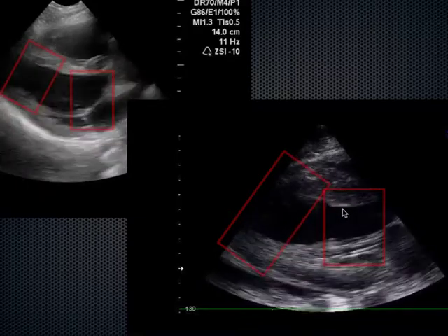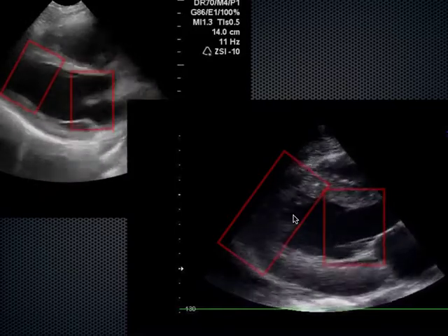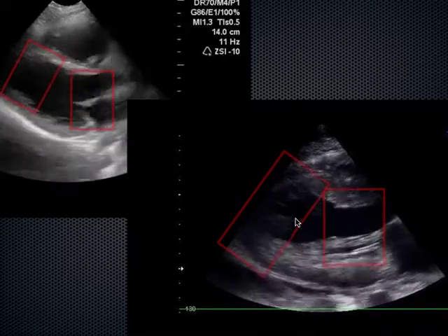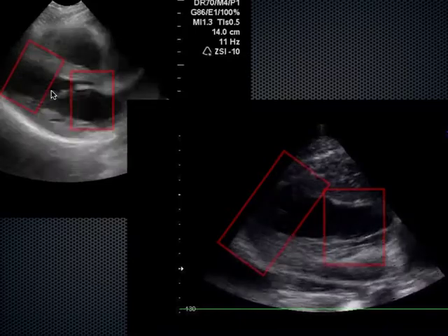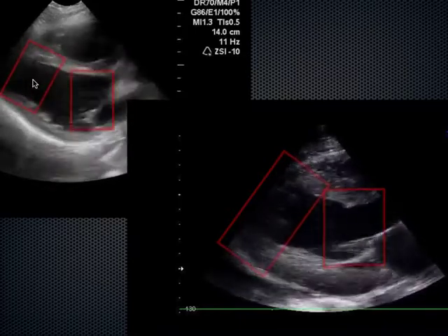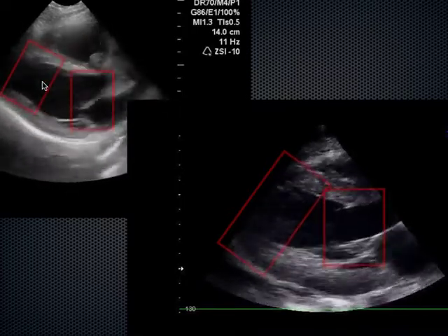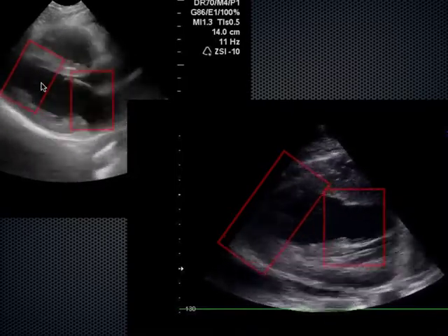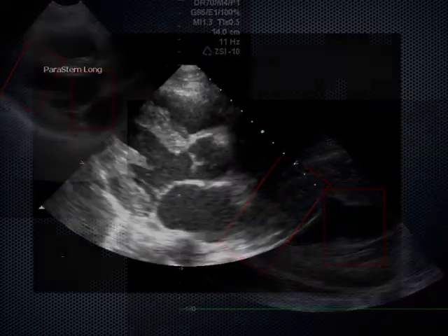The second problem is that we see back here in this left ventricle, if we're an imaginary red blood cell sitting right here, we don't make out very well that this interventricular septum and this posterior wall are coming together to any meaningful degree the way it is over here. You can see up here there's pretty good delta in the chamber sizes between end systole and end diastole. There's a good difference in that chamber size because the interventricular septum and posterior wall are really squeezing together well. And so right off the bat, we look at this heart and we go, okay, definitely decreased LV function.